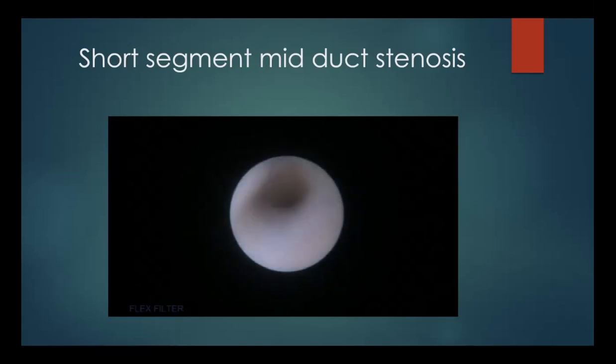In this, I'm trying to force my endoscope right through. I'm using the 1.6 millimeter diameter sialendoscope for this procedure. And you can see I'm really trying to negotiate the duct without going outside the duct. Constant irrigation is maintained so as to keep the lumen visible, because once you lose the lumen, you can really cause all sorts of problems.